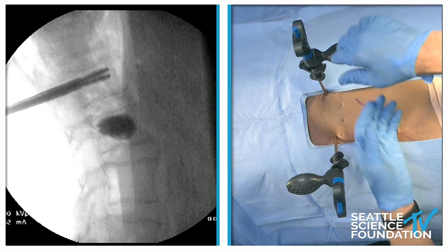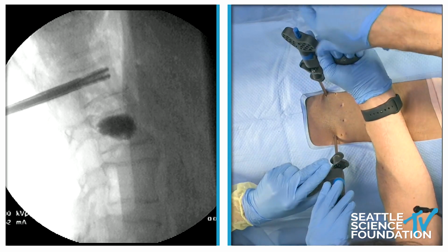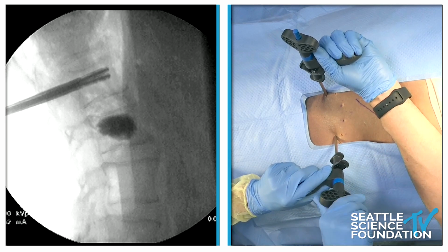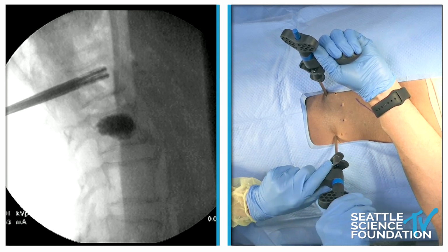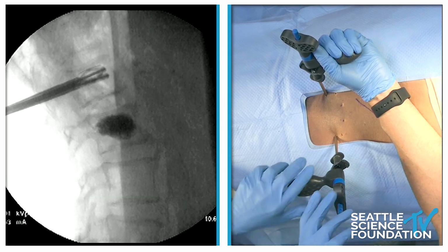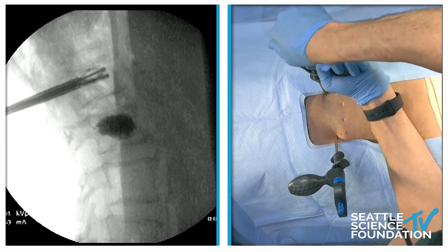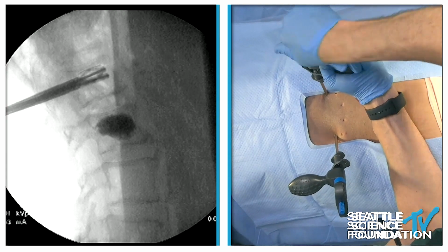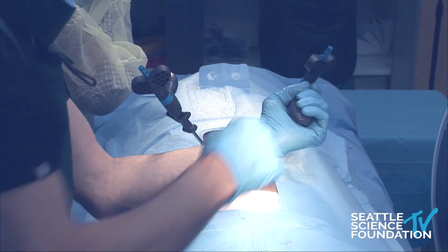That's all we need. So I'm going to start here, and there's going to be 2 or 3 turns in the butterfly handle. Let's go ahead and do that, 2 or 3 turns. Keep on going. And we can start to see the spine jack start to lift. Keep on, 2 or 3 more turns. See it start to lift there, and we'll do 2 or 3 turns on this side. You can see the skis expanding away from the center. 2 or 3 turns on this side. You can see the ski. 2 or 3 turns on either side.